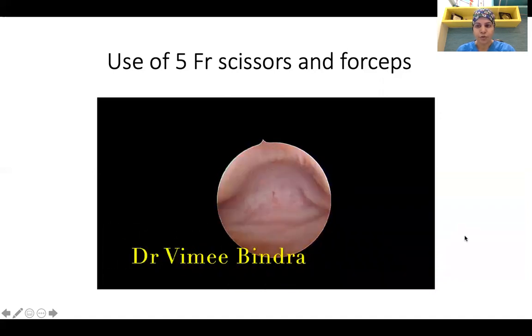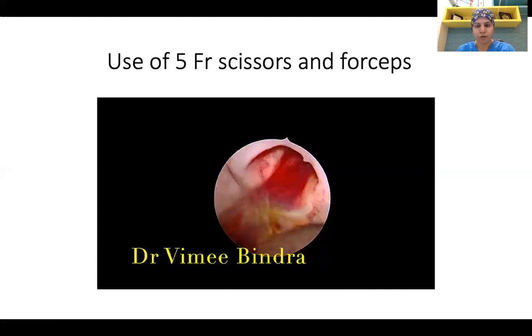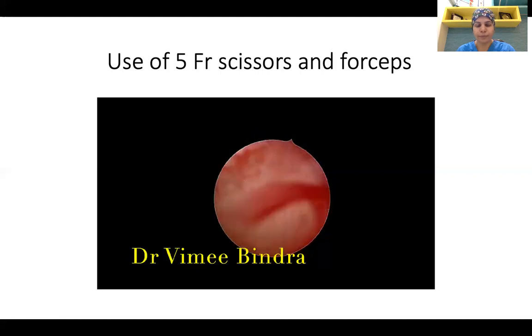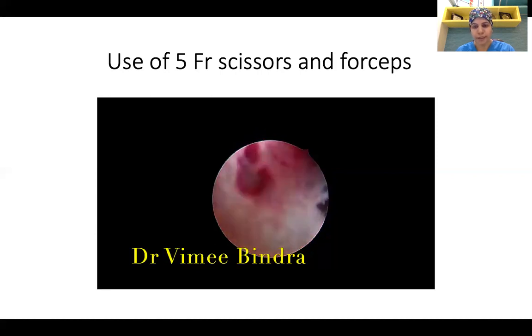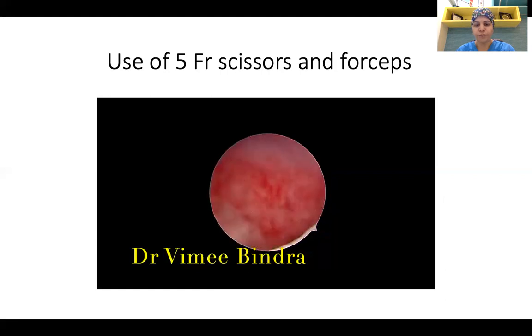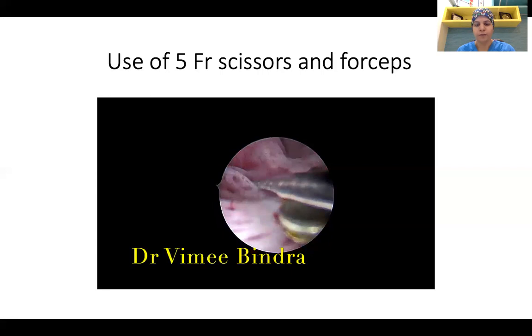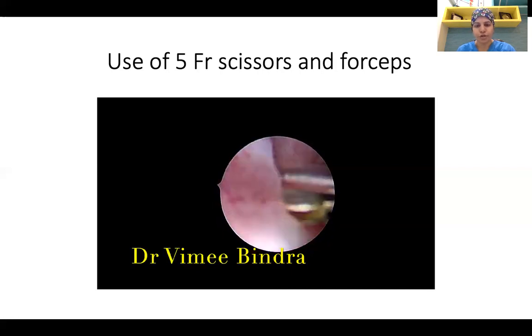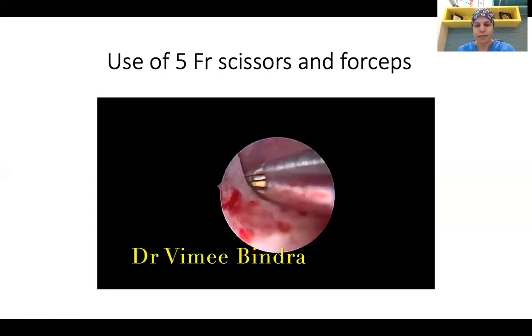How do we perform this procedure? It is as simple as other hysteroscopic procedures. If you are using a Betocchi hysteroscope or a 2.9 mm hysteroscope, it can be done in the office setting without anesthesia, especially for Type 0 and Type 1 RPOCs. We usually perform vaginoscopy followed by hysteroscopy in all cases. In this case we used the Betocchi hysteroscope and are removing RPOC by cold scissors. We avoid using the active electrode if not required or if there is no bleeding.